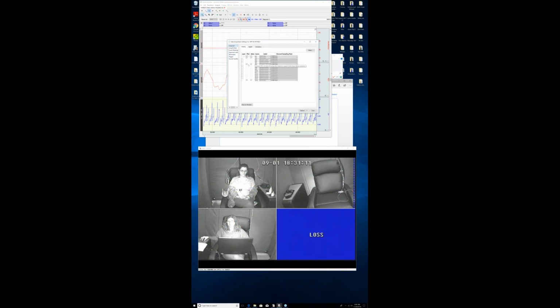I had the LED connected, but I realized it was easier to give you a demo of the LED with me in the control room, so at the last minute I removed that and brought it into the control room. And we've got respiration. So that's everything set up from the physiological aspect.